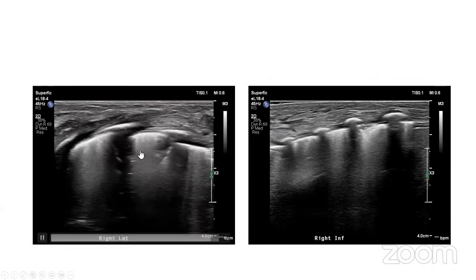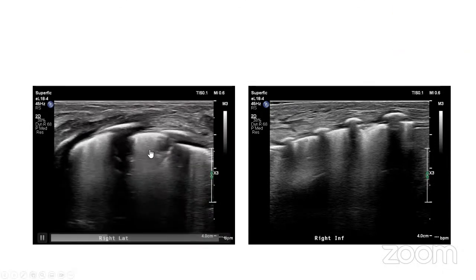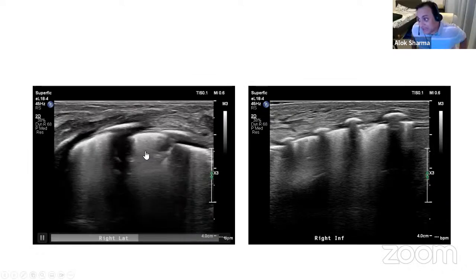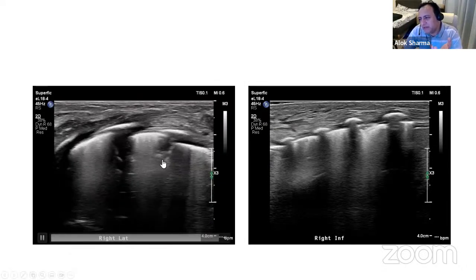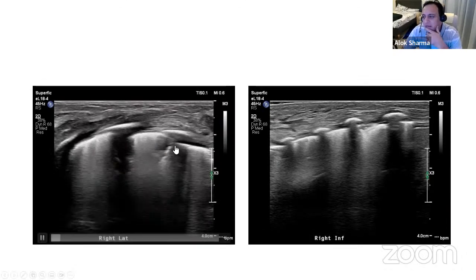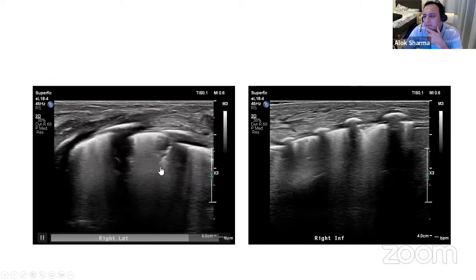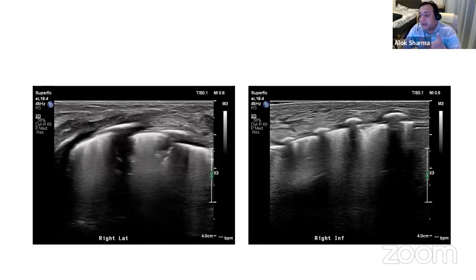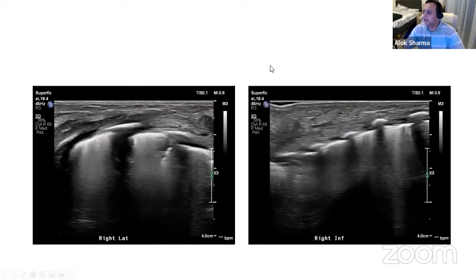Can I ask? I thought initially it looks bright like an air bronchogram. Okay. But the pattern looks different. I agree. It looks more like consolidation. So what I'd say to you is that consolidations can have air bronchograms in them, but they're not as bright. If you remember how I showed you that they're very bright when you see them. So my gut feeling is the pleura is also irregular at this particular point, with a slight area that's dark. I think that's an area of consolidation. I'm not entirely sure that is an air bronchogram. But again, this is just a consolidation in one space. And actually, if you do more spaces, and this is just in the right inferior.